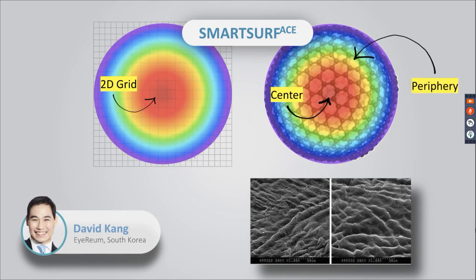surface should improve the periphery much more than the center, because the fullerene ring works even better in the periphery, where the pulses, if we use a grid technology, are not really well put next to each other. And that's why we have in general more haze peripherally in hyperopic PRK.